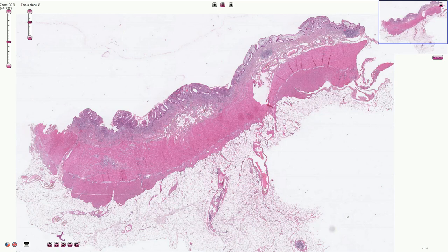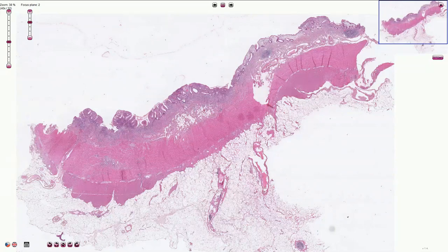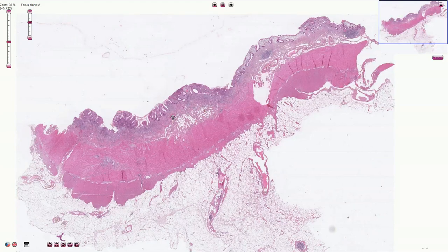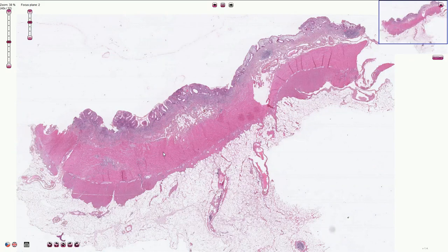It only affects the colon and other parts of the gastrointestinal tract are not involved. Here we have the part of the colon affected by ulcerative colitis. The inflammation is typically superficial and it affects only the mucosa. The deeper structures are spared.